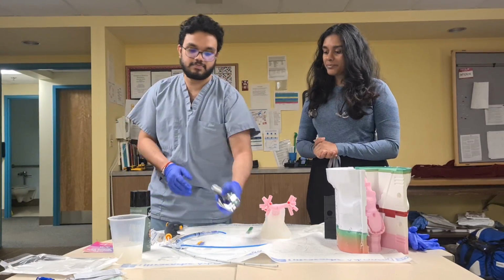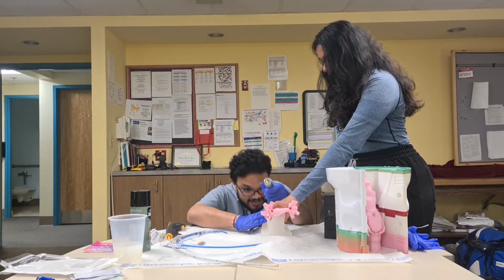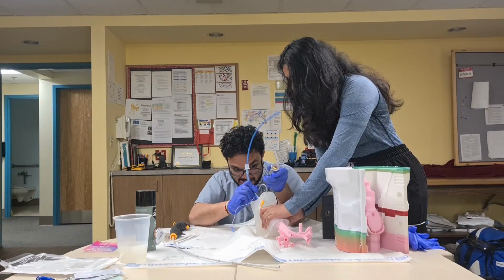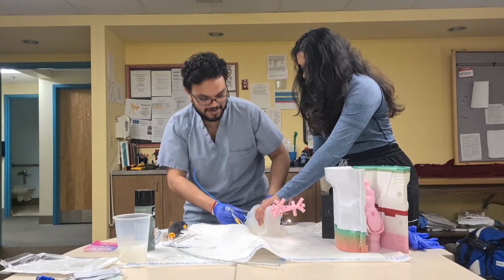Right now, yeah, so I've got my Mac blade, getting down on my knees, as every good ER provider should be. Yep, it's in. That took some finessing, but it's in.